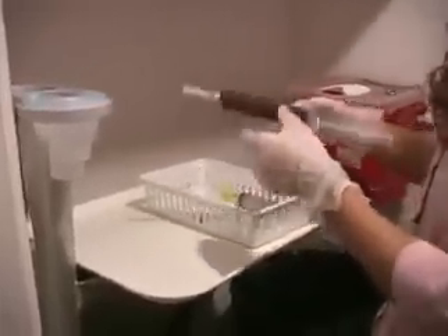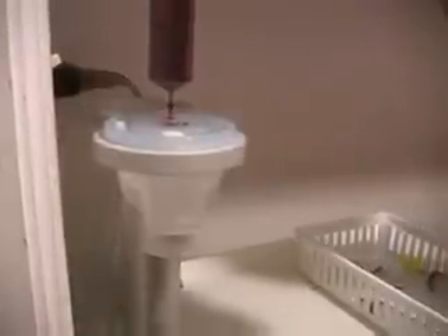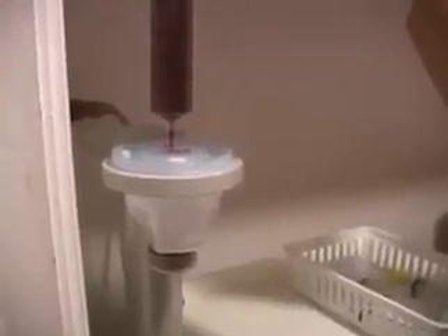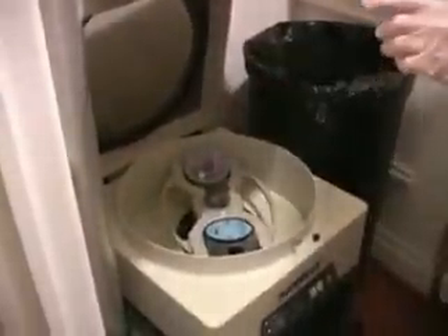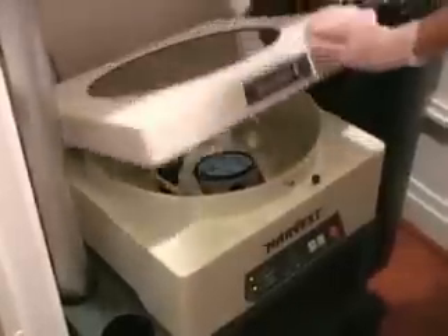Here you'll see the medical assistant putting the person's blood in a specialized plasma chamber. This plasma chamber has a specific filter that will separate out the platelet-rich portion of the blood. The whole centrifuging or processing of the blood takes anywhere from 10 to 15 minutes. Ultimately, we'll get out the platelet-rich portion of the blood. The platelets are specialized blood cells that are basically storehouses for growth factors — the growth factors normally needed by the human body to initiate the healing of connective tissue, such as ligaments or tendons.